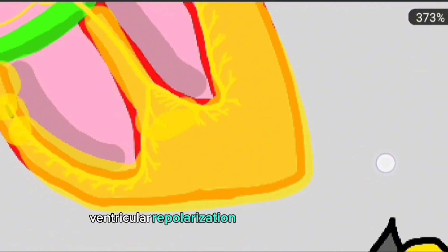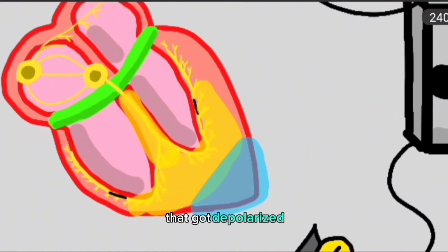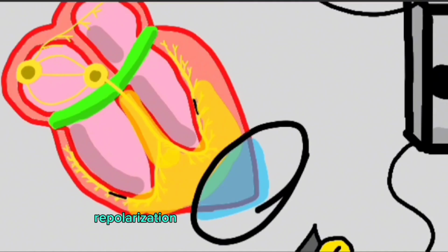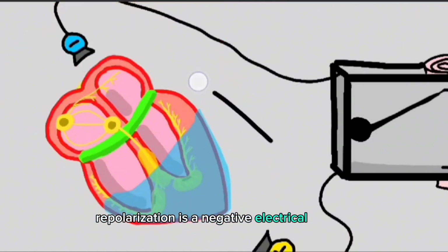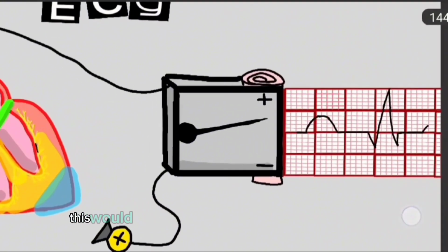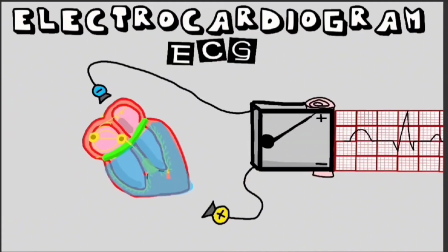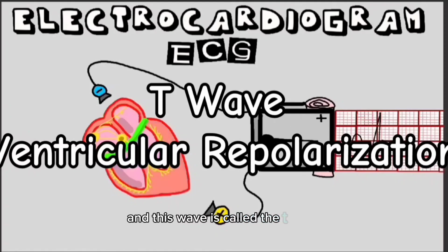Ventricular repolarization starts at the last area that got depolarized. Repolarization is a negative electrical current moving towards the negative electrode. This would be read by our machine as a positive wave, and this wave is called the T wave.